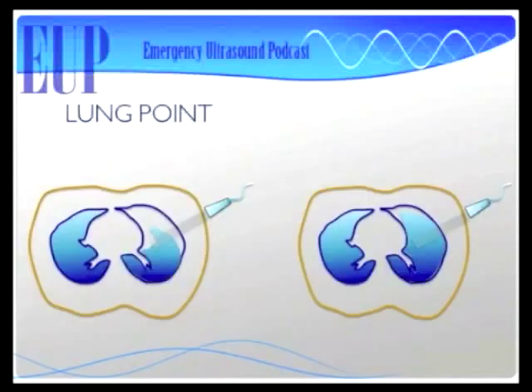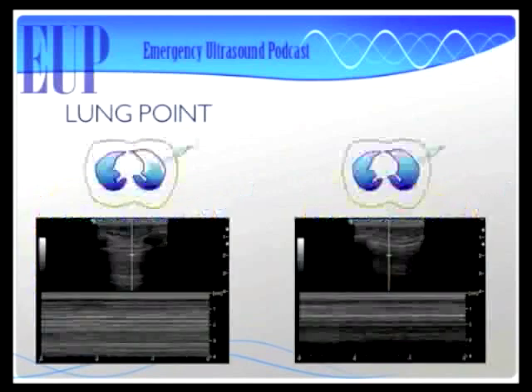The lung point is something that I learned about from Lichtenstein too, and he uses this idea where he starts anterior with his probe, and he'll see a pneumothorax, and then he'll keep going lateral and then posterior until he no longer sees pneumothorax. And that point where he converts over from pneumothorax to positive lung sliding, he calls the lung point. And the theory is you can use that lung point and where it is on the patient's body to get an idea of how big their pneumothorax is.